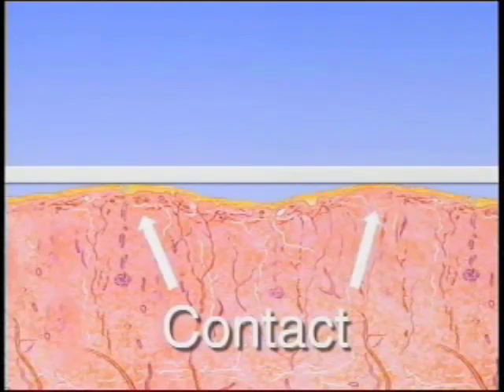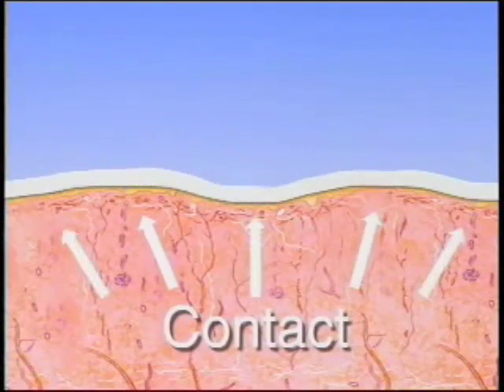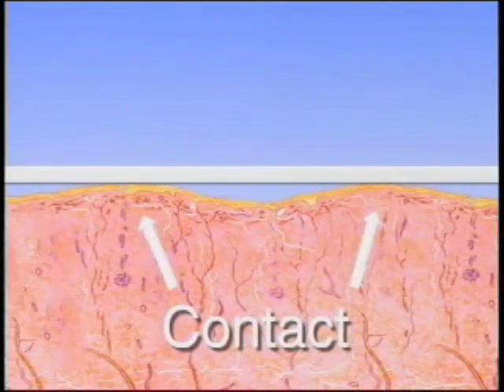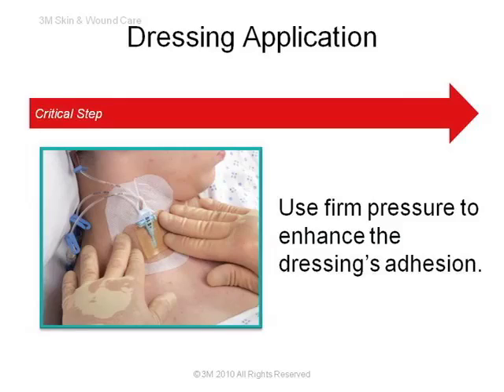When firm pressure is applied to the adhesive film, a greater amount of adhesive is pushed into the valleys or nooks and crannies of the skin surface, thus allowing more adhesive to be in contact with a greater amount of skin surface and providing better overall adhesion of the dressing. Continue to smooth the Tegaderm CHG dressing from the center towards the edges using firm pressure to enhance adhesion.